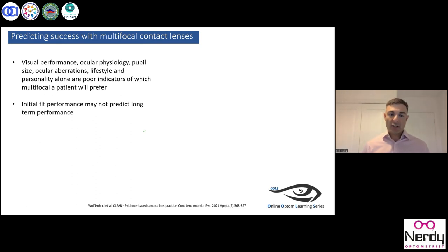And like I said, there is that neural adaption process. And that's why we usually say, take them away and give them a chance to experience the lenses and see what happens around 2 weeks later. So that neural adaption in some can take up to around 15 days for them to really use that lens to its best potential. And I always say, try it at home at first, in a safe environment.